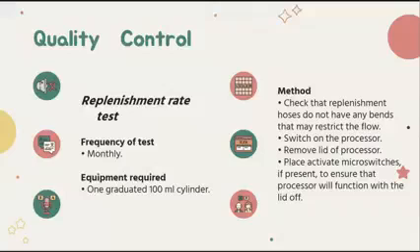Okay, so your micro switches function when the lid should be on, naka-cover dapat ang mga processing chemicals with the lid. Okay, because without the processing lid, your micro switches will fail unless you manually activate your micro switch. Okay, so di ba, the micro switch plays an important role to check the replenishment rates of your chemicals. Okay, because once the micro switch is activated, your replenishment system is also activated or triggered.